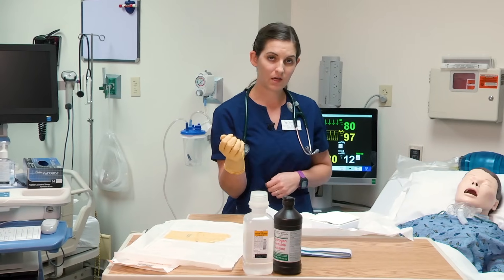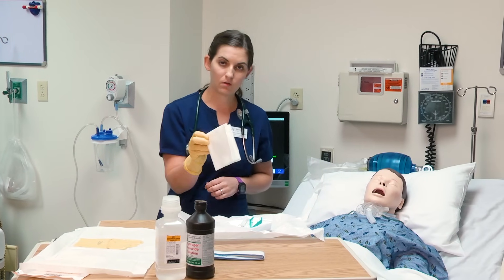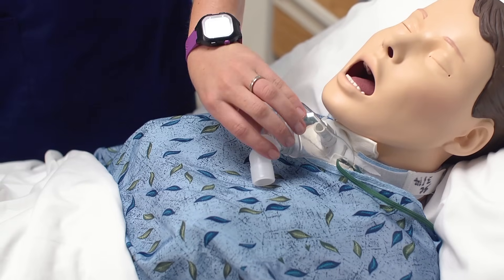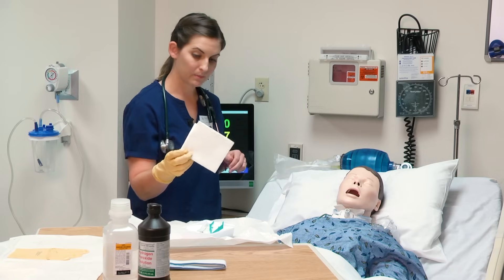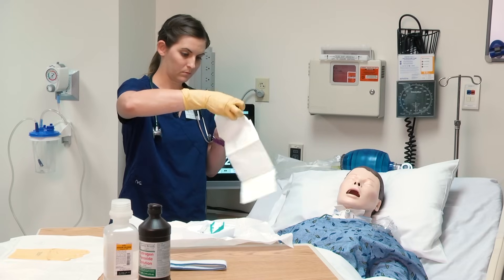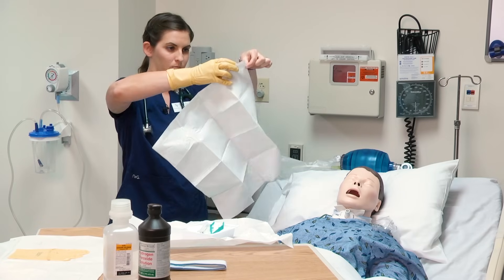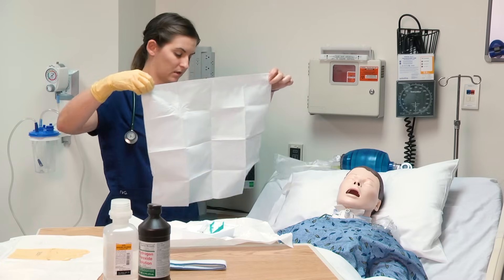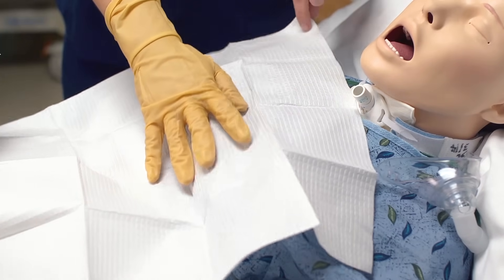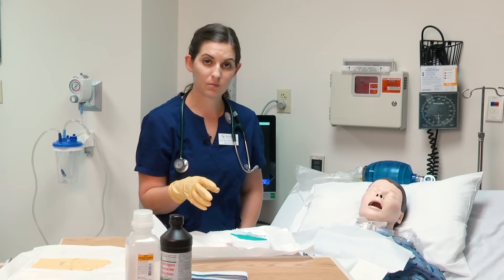I now need to arrange my supplies on my sterile field. The first thing on top of the tray kit is a sterile drape to put on the patient's chest. I'm going to move my mist collar and drape my patient — shiny side goes down. I don't want to lean over my field. I can touch in the middle of the field but not around the one-inch border.